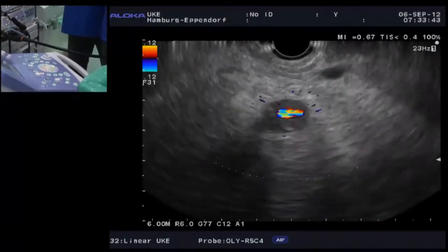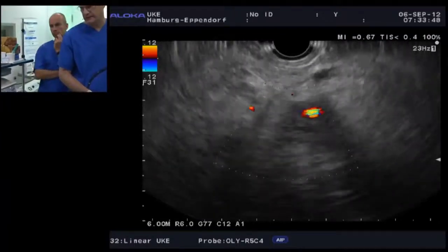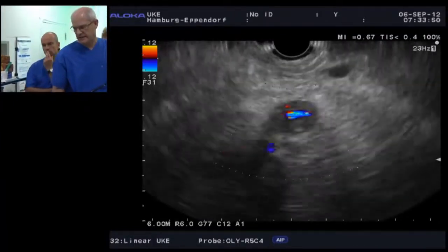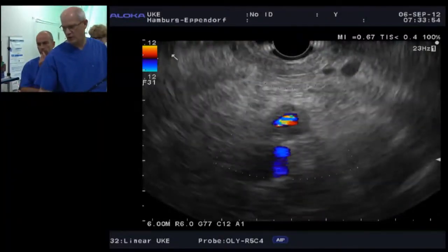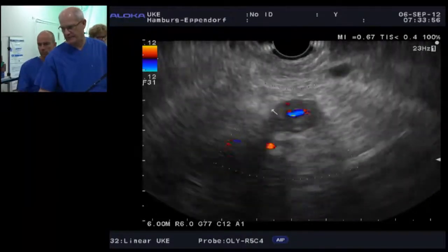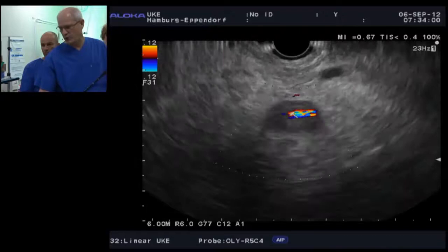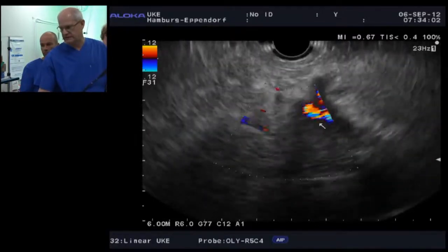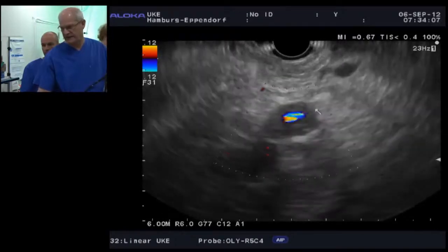But I think you're right, Mike and Dong-Wan. I think everybody. My guess is that this is something that's tracking along the artery and probably emanating from the head. That lesion in the head wasn't reported on, at least on the CT. But you can see a very impressive halo around the celiac artery.